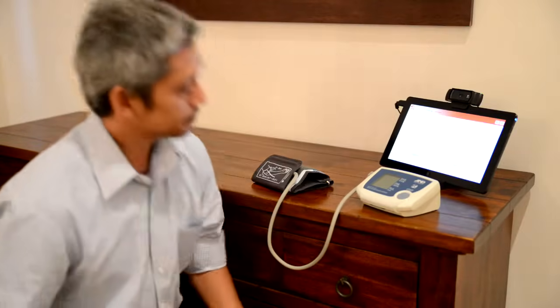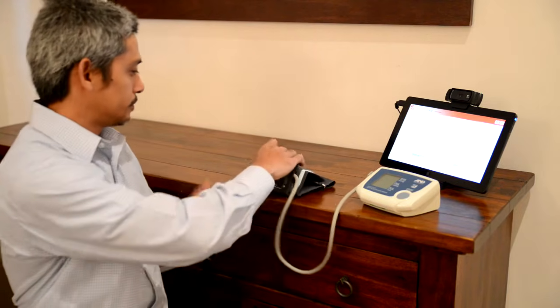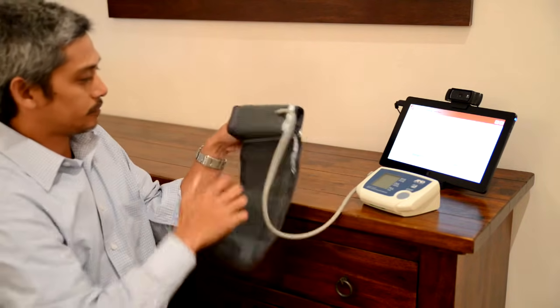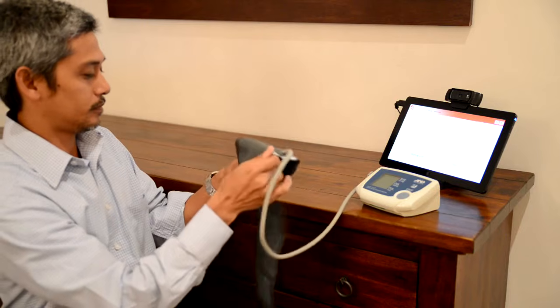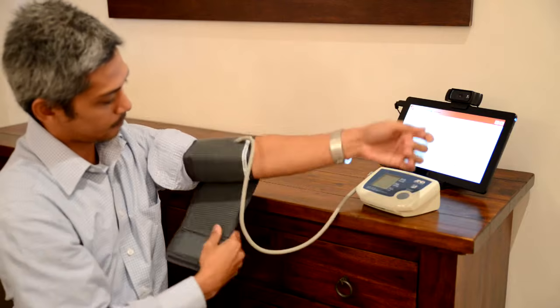When prompted to take your blood pressure, please sit down on a chair near the blood pressure monitor and relax. Wrap the cuff around your left upper arm against the skin and with the velcro on the outside. Ensure the tube is on the inside of your arm.